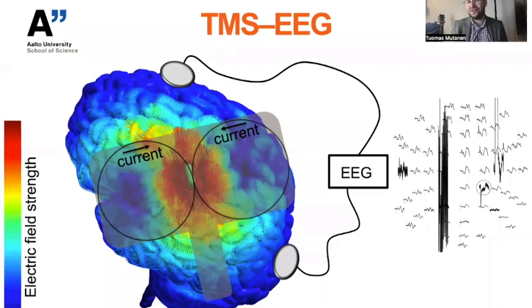So, of course, the idea of combining transcranial magnetic stimulation with electroencephalography is to measure directly the responses of the cortex when we stimulate it with the transcranial magnetic stimulation. Unfortunately, the strong magnetic pulses also easily create many sorts of artifacts and noise signals that we would want to remove before we start to analyze the interesting good stuff that is the TMS-EEG of the brain.